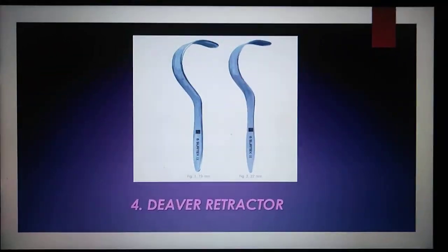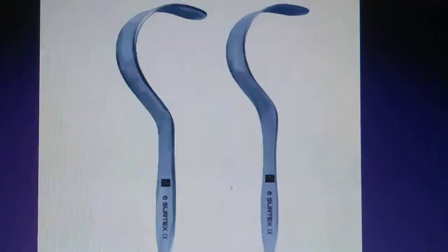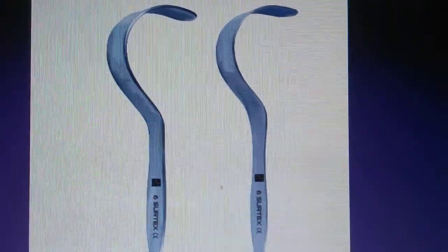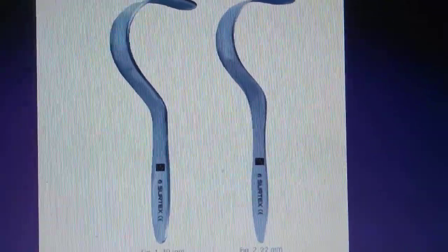The fourth one is the Deaver retractor. The Deaver retractor is used to widen the surgical incision and hold the larger organs contained inside the abdominal cavity during a wide range of general surgery procedures.